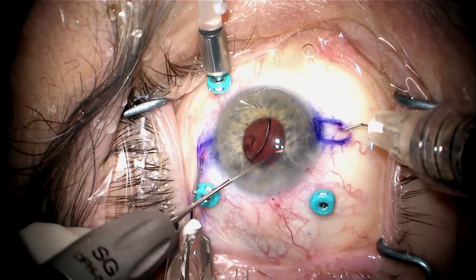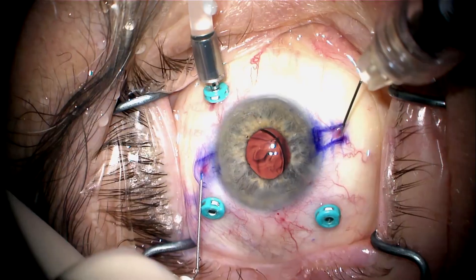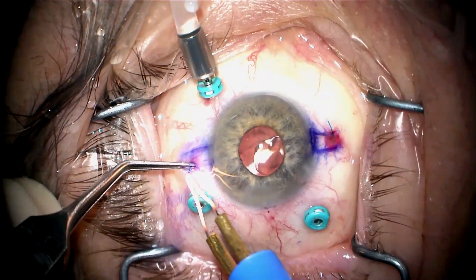The haptic has to slide right in without any force. Now both needles are going to be withdrawn from the eye, externalizing the haptics. The infusion is on while I do this, and you can see the chamber remains very well formed.